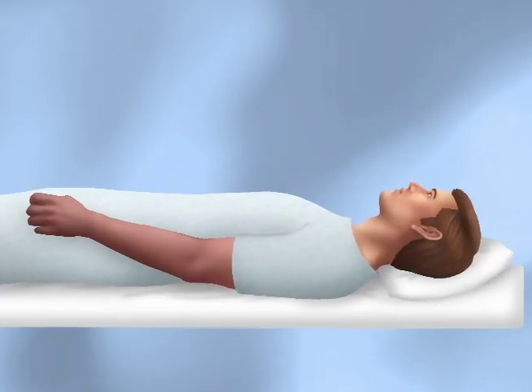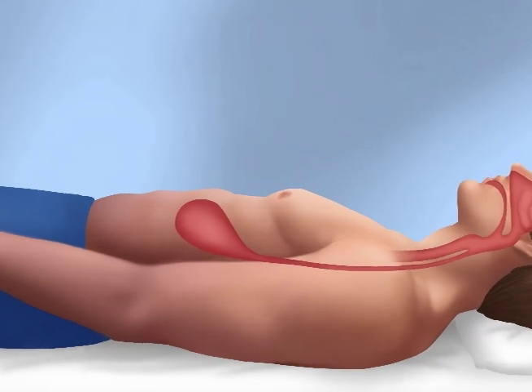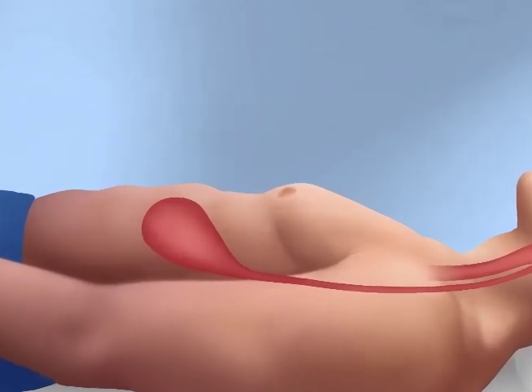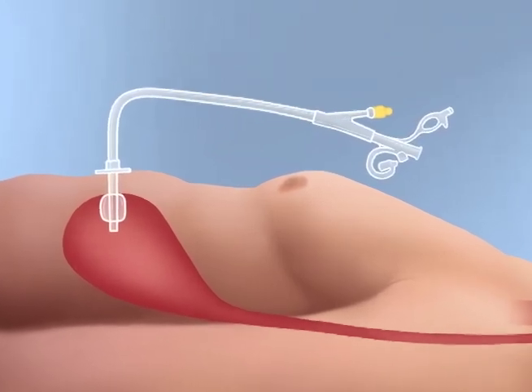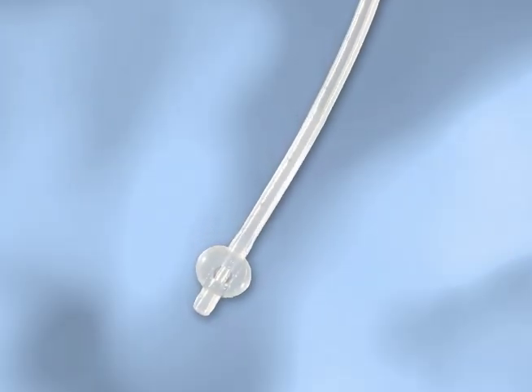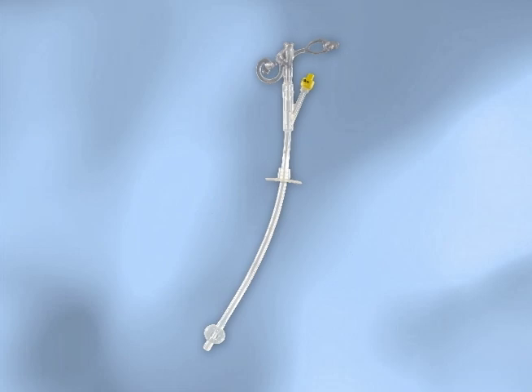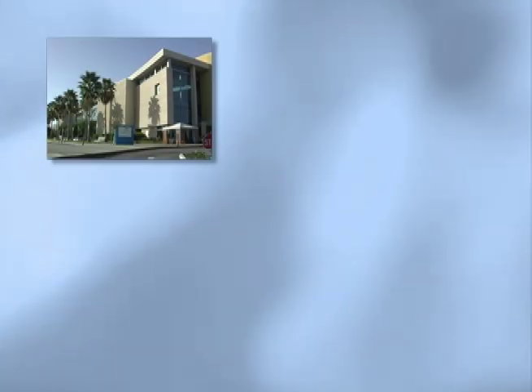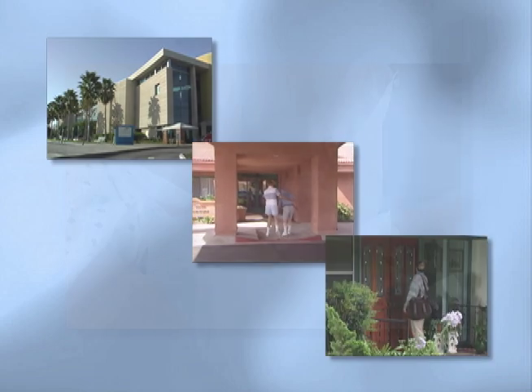Replacement balloon gastrostomy tubes are used in patients who have well-formed gastrostomy tracts. Most of these patients cannot tolerate oral feedings and require long-term tube feedings to meet all or part of their nutritional needs. Replacement balloon gastrostomy tubes are being used more and more in a variety of health care settings, ranging from acute care to long-term care and nursing homes to home health care.